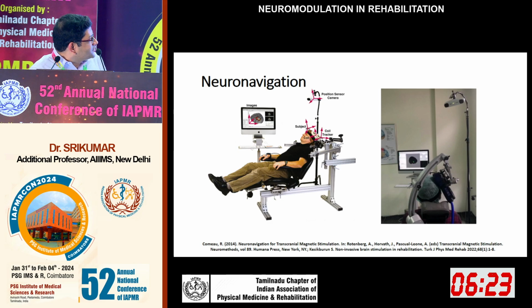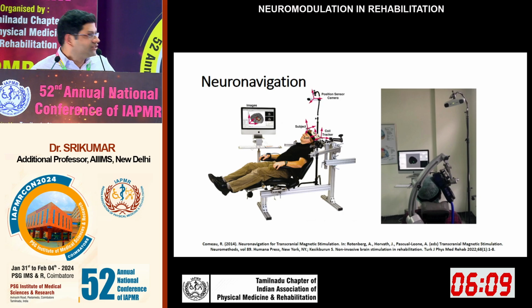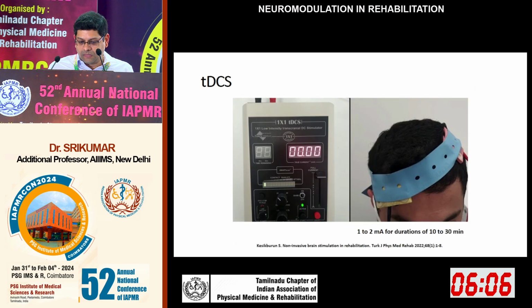On the image that is picked up by the camera, and also this camera picks up the image of the head and also that of the coil, and it superimposes on the functional MRI, and it helps to navigate the system. That is like a stereotaxic effect.